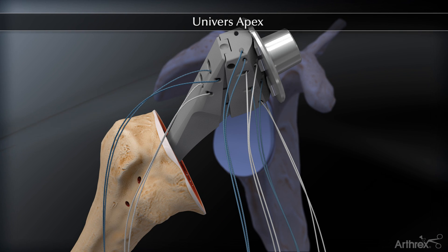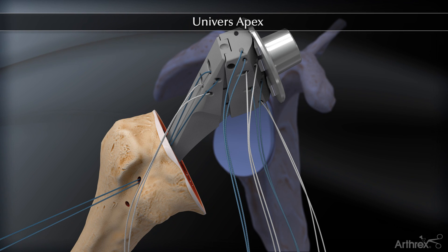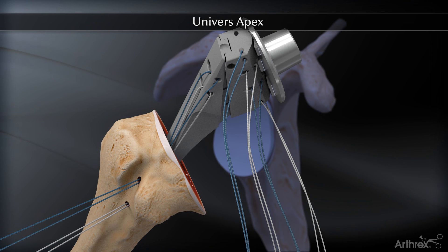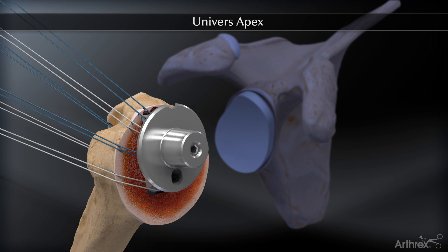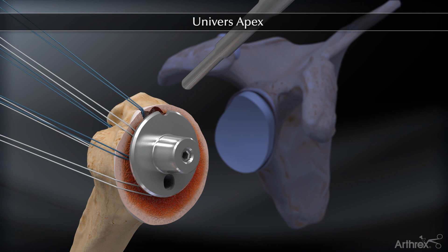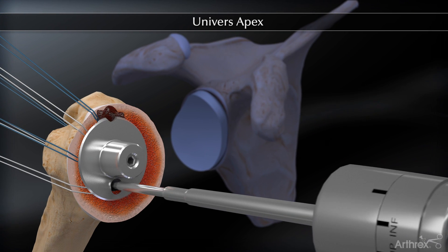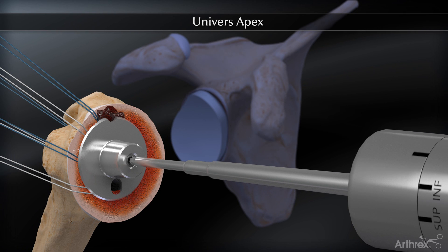Limbs A and B are passed through the superior hole from the intramedullary canal out. Similarly, limbs C and D are passed through the inferior hole from the intramedullary canal out. All strands are held out to length on tension as the stem is implanted and impacted with the pointed stem impactor, followed by the angled morse taper stem impactor, placing the trunnion flush to the osteotomy surface. The inclination, inferior, and version, superior screws are then tightened with the torque driver.